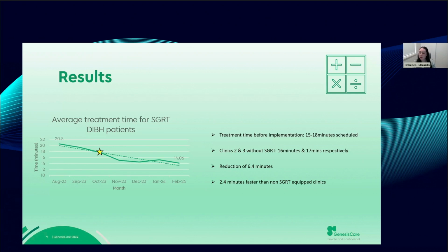And lastly, the several monitors that sit in the treatment console that only the radiation therapist can monitor, which show the patient's external surface at all times as it relates to their original planned scan, the isocenter tolerance by measurement, which we have in millimeters, and the same gating box system, which the patient can see.